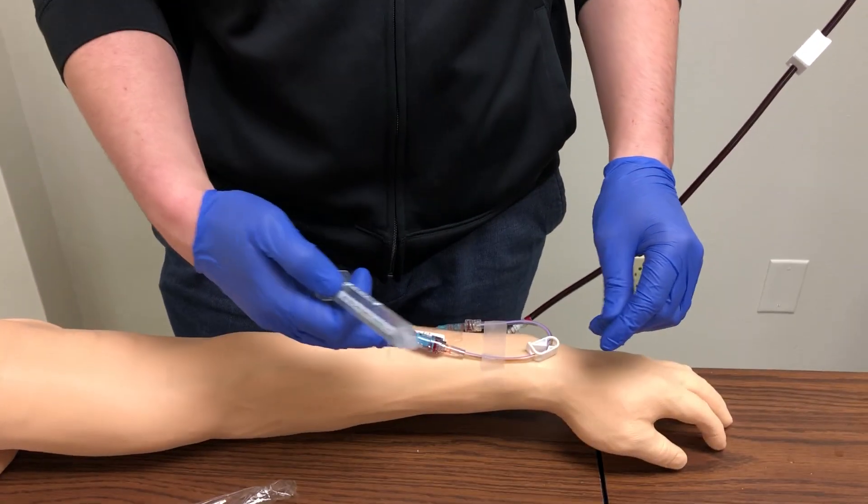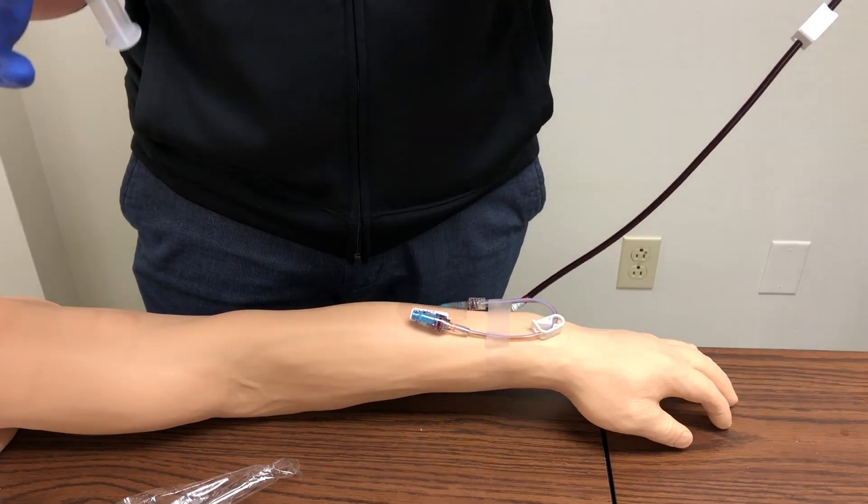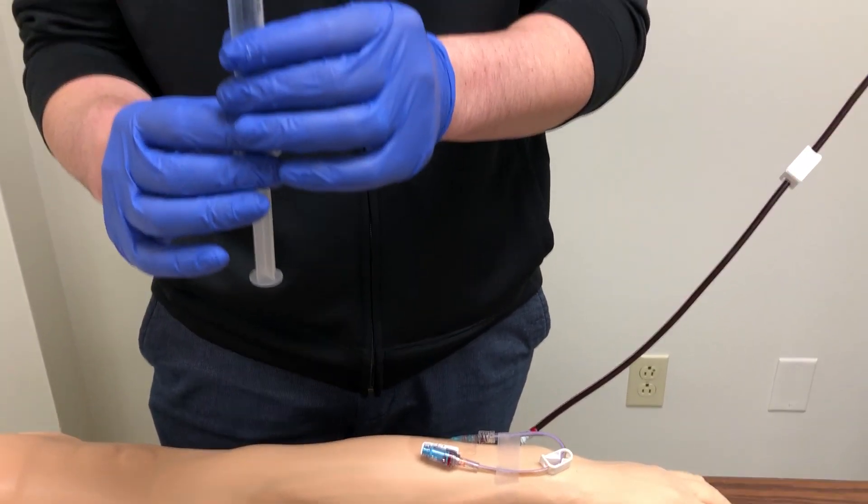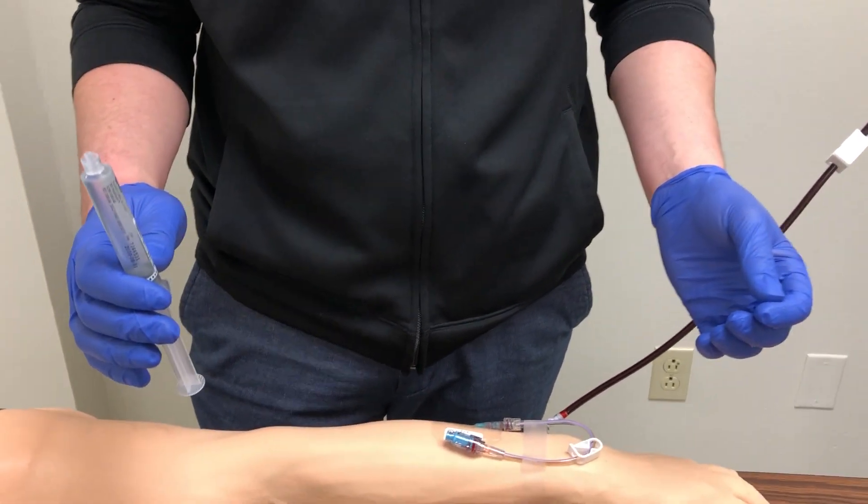So I've completed my alcohol swab for 15 seconds, confirmed I have my order, broken the seal, and ejected the air. Now I am ready to perform my saline flush.